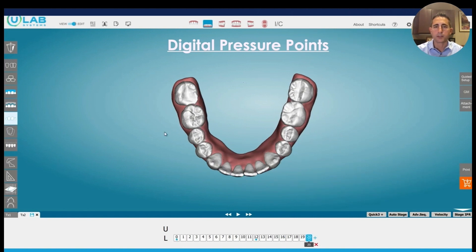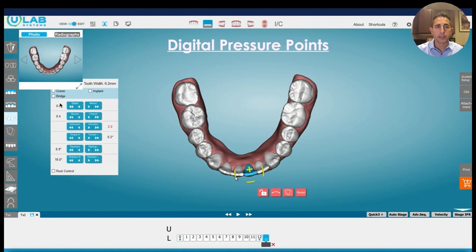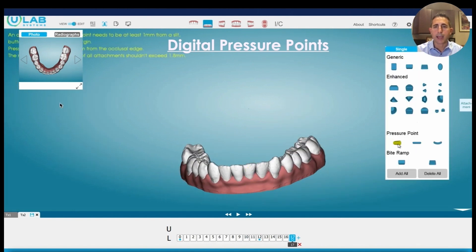If you looked in the mouth, you might see that the aligner is sticking out a little bit in that area. But we still have the ability to place force on these teeth. We have a lower left one here that is rotated — it's supposed to be straight according to the software and what we set up initially. We're going to go ahead and add a keyframe, just like we talked about before, to overcorrect the rotation. And if we want to increase the force even further, we can add pressure points.